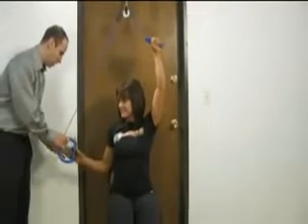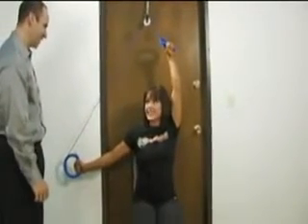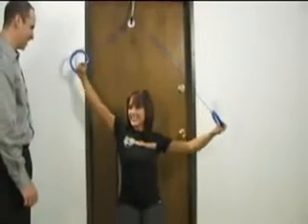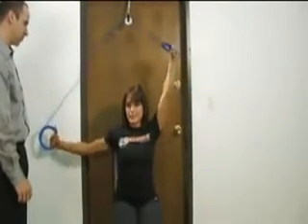and hold it there and give it a try there. That already stretches you more, just that angle. Definitely. Harder to keep your wrist straight, a lot more stabilization.